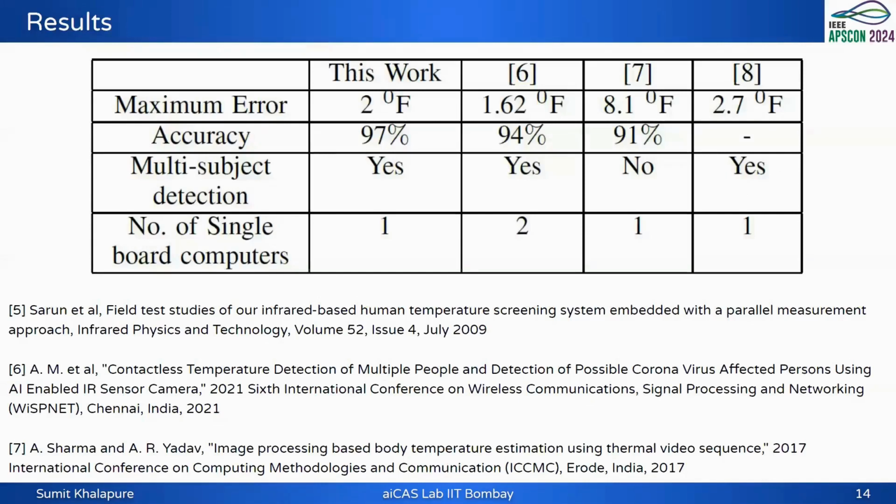Regarding the results compared to others, this work is still in the initial phase, where we have an accuracy of within 2 degrees Fahrenheit. It does multi-face detection, and multiple temperatures will be shown on the screen simultaneously. We can see that in real time.